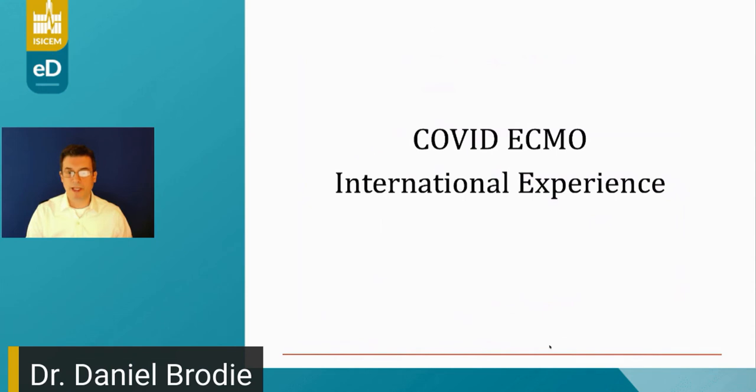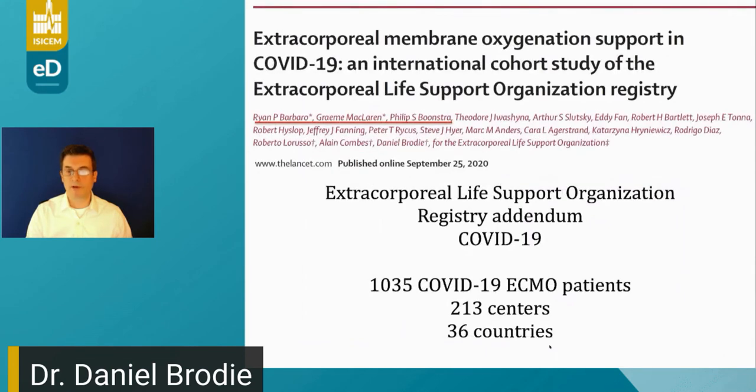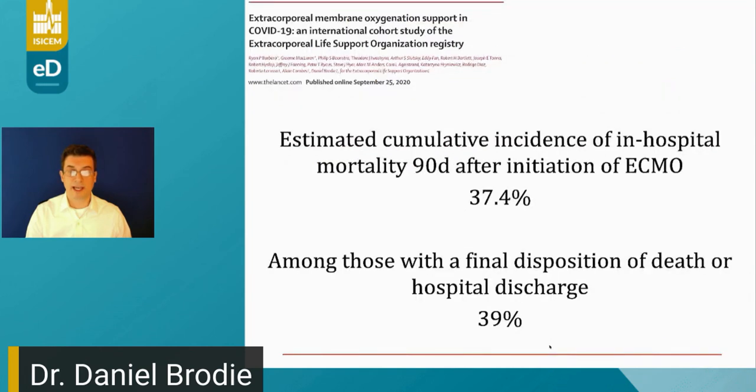Similarly, we published the international experience through the Extracorporeal Life Support Organization. I want to point out my colleagues Ryan Barbaro, Graham McLaren, and Phil Boonstra, who did tremendous work on this project. We had a registry addendum specifically for COVID-19 and prospectively collected data on the COVID-19 patients. There were 1,035 COVID-19 ECMO patients included from 213 centers across 36 countries. And ultimately, the estimated cumulative incidence of in-hospital mortality, similar to the French study, at 90 days was 37.4%.